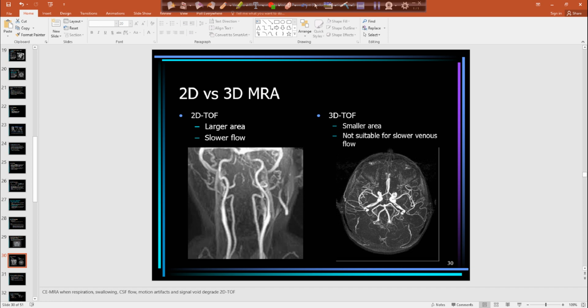So that's why this type of imaging, MRA imaging, is really useful when a patient has an allergy to gadolinium, or is just contraindicated for gadolinium altogether. Maybe they have some kind of renal insufficiency where their GFR is pretty low and they can't get contrast because they can't filter it out. Maybe they're a dialysis patient. Maybe they're a patient that gets repetitive scans because they have MS. They need to not have gadolinium so often. A good way to visualize the vessels would be time of flight.